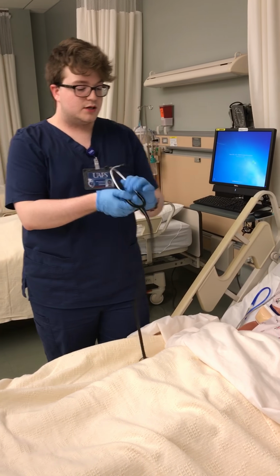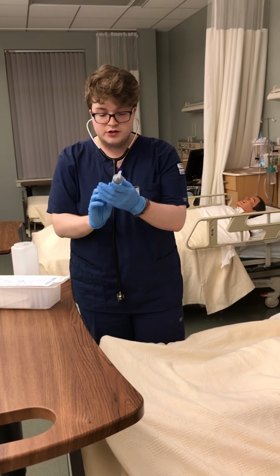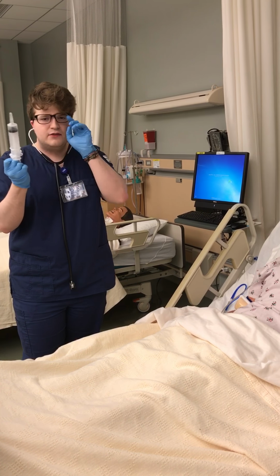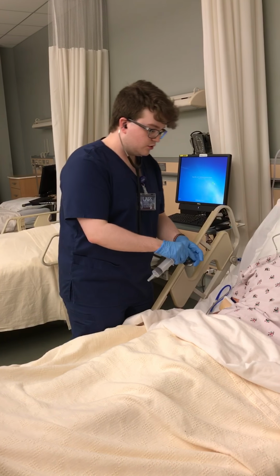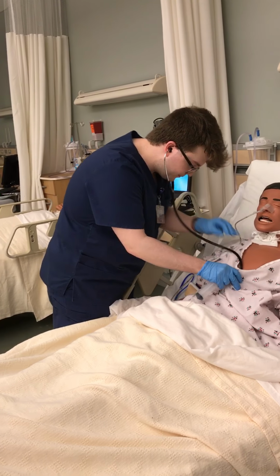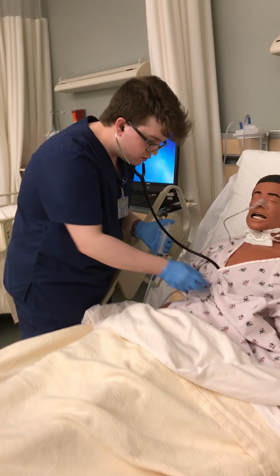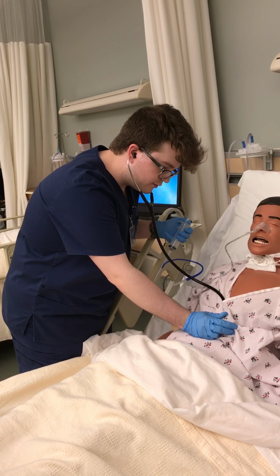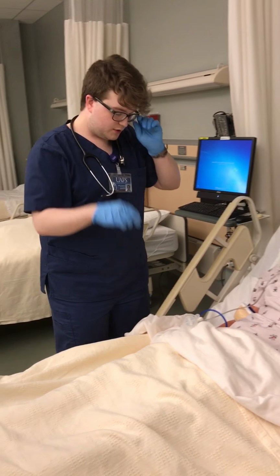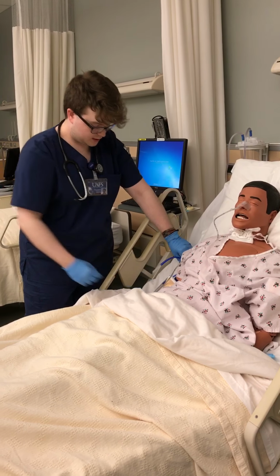The first thing I want to do with NG tubes is check for placement. And the way I'm going to do that is grab a syringe that I've already had set up in here, and you want to do about 10-15 milliliters of air into the tube. I want to make sure that I get down here at the stomach. We're just listening for air bubbles. Unhook this, get this set up, and I would listen for the bubbles, and we did hear them. So it's in the right location still.